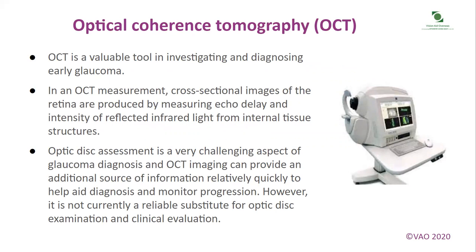Optical coherence tomography, or OCT, is a valuable tool in investigating and diagnosing early glaucoma. In an OCT measurement, cross-sectional images of the retina are produced by measuring echo delay and intensity of reflected infrared light from internal tissue structures.